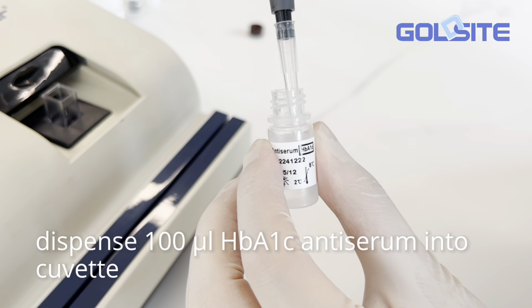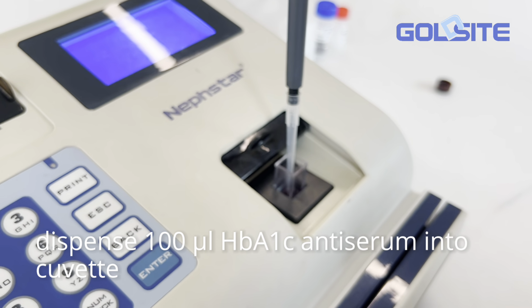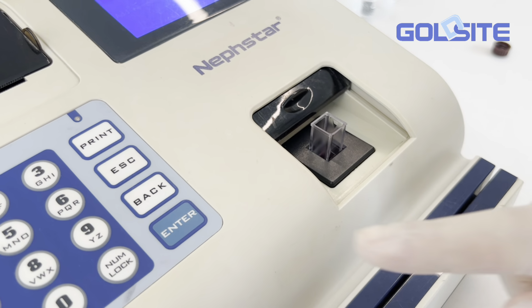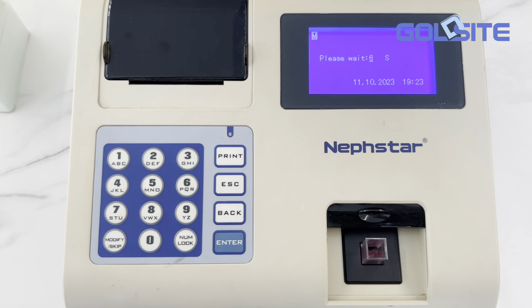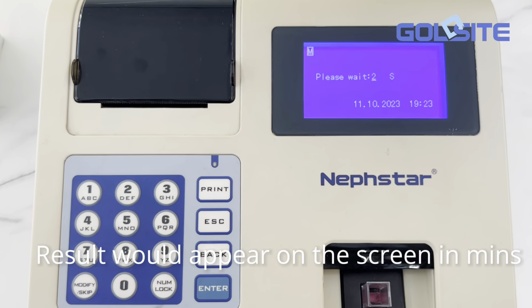Dispense 100 microliter HbA1c antiserum into the cuvette. Press Enter button to start the test. Result would appear on the screen in minutes.